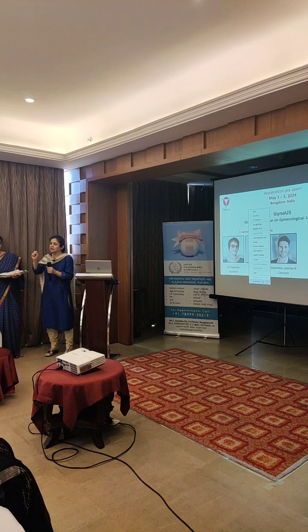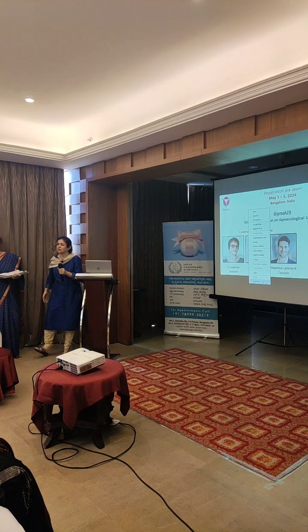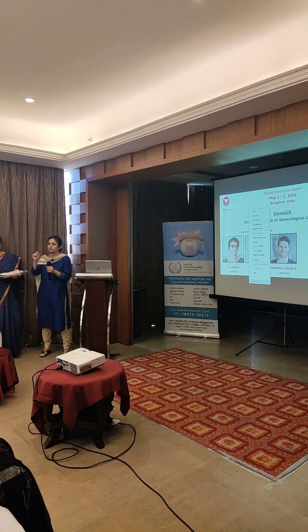The only time I think MRI will score above ultrasound in endometriosis is when you're seeing parametrial and deep parametrial invasion into the sacral plexus. So if you have a patient with dysmenorrhea, endometriosis, pain radiating down the leg, hip pain, those are the patients where I think we may not be able to do a good scan, and many of these are young women, we may not even be able to do a transvaginal scan. So if you cannot do a transvaginal scan in a young girl, another option is to do a transrectal scan, but honestly I'm not very comfortable, and maybe I'm not good enough, or I have not had enough experience.